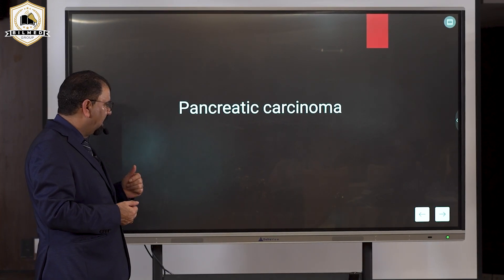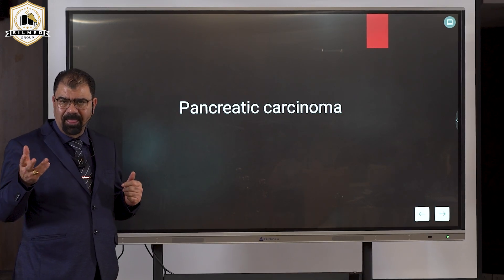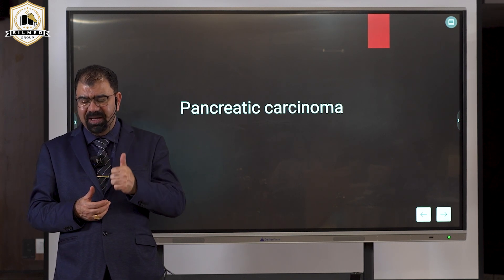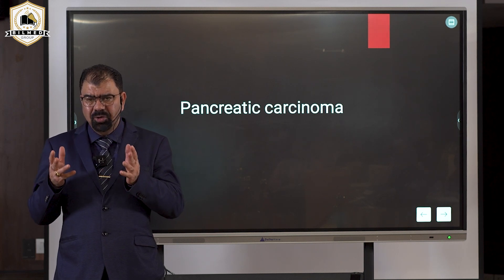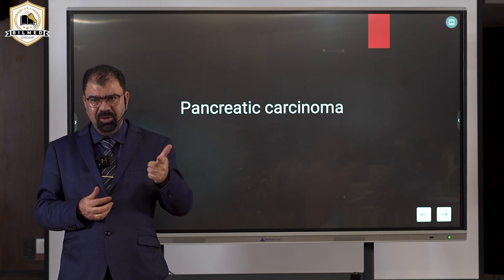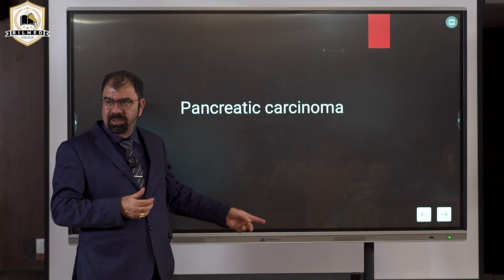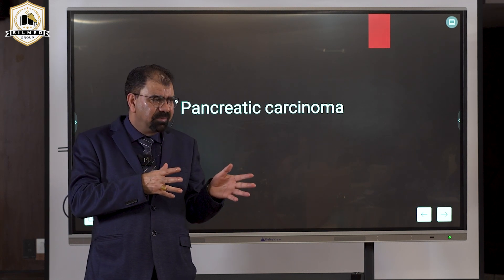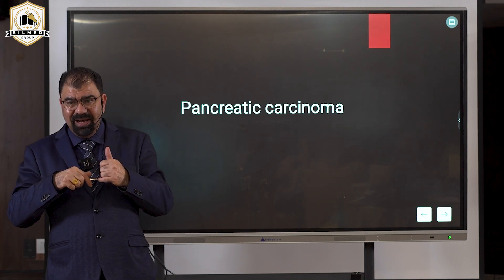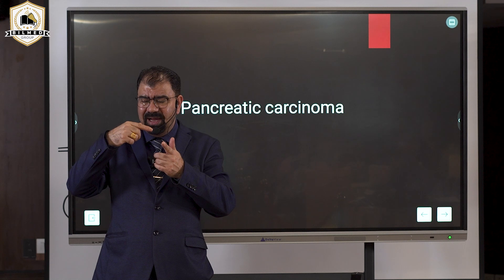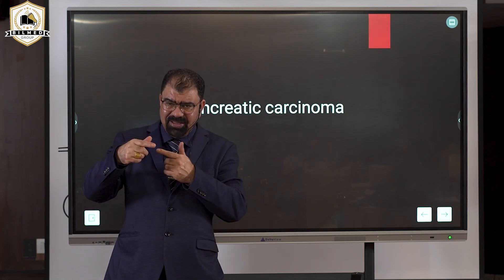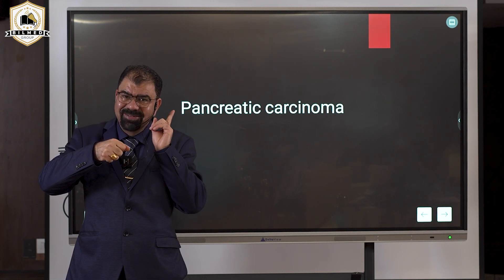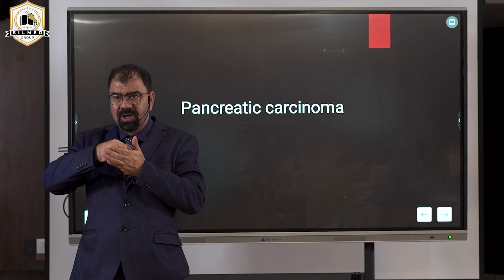If there is a focally spared area in a lipomatous pancreas, that will not show high vascularity. Also, will there be any mass effect in a focal sparing area? No. But if it is carcinoma — usually in the head of the pancreas — it will compress onto the biliary tract. So if it is a true carcinoma patch there, I will be having dilatation above.